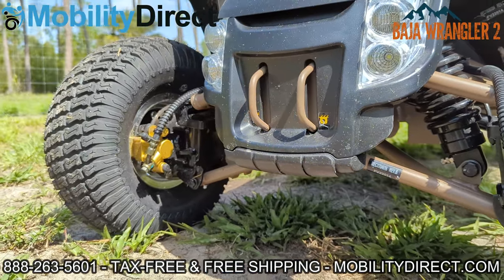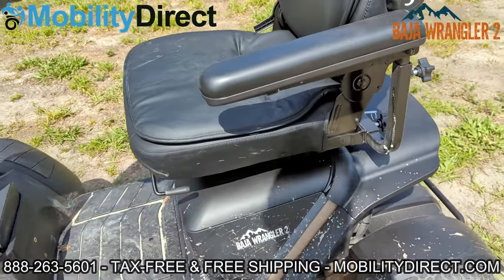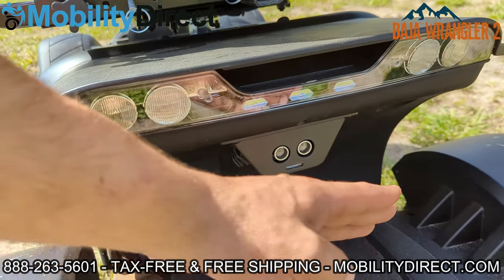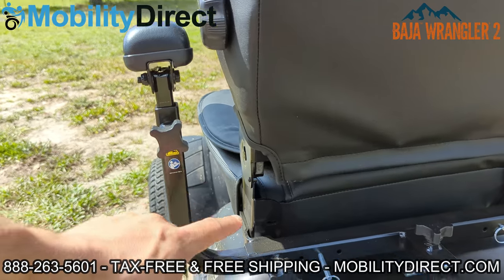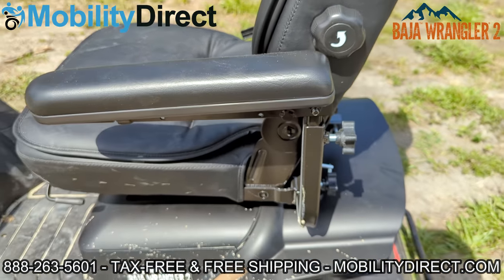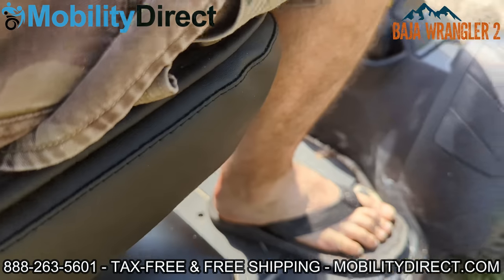They have done some new things with the tie rods — the turn rods on the front — and we'll have all that information on our website at mobilitydirect.com. I'll show you the reverse rear backup sensor, which starts beeping if you get too close to anything. It also has a universal one-inch hitch adapter on the back. The armrests are height adjustable and width adjustable. You can also raise and lower the lumbar support, slide the seat forward and backward, as well as rotating it — there is a rotation lever on the right side of the seat.